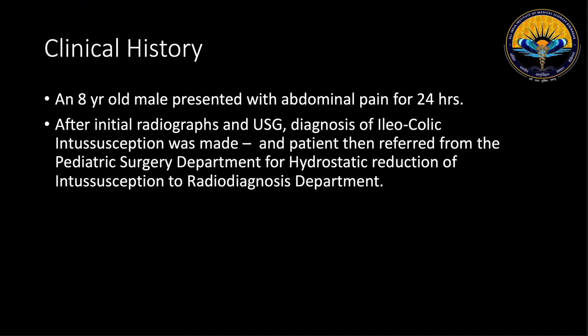So an 8-year-old male presented with abdominal pain for 24 hours to our institute, and after initial radiographs and USG, diagnosis of ileocolic intussusception was made. The patient was then referred from the pediatric surgery department for hydrostatic reduction of intussusception to our department.